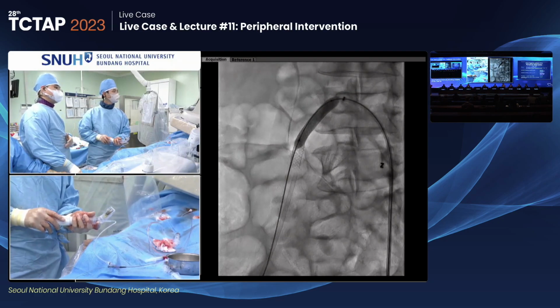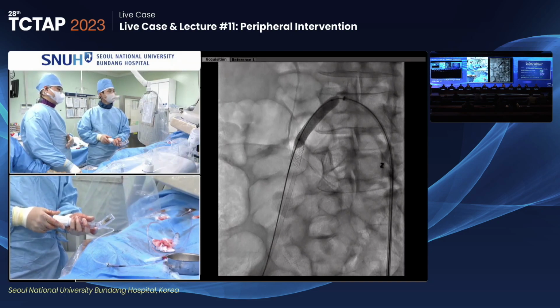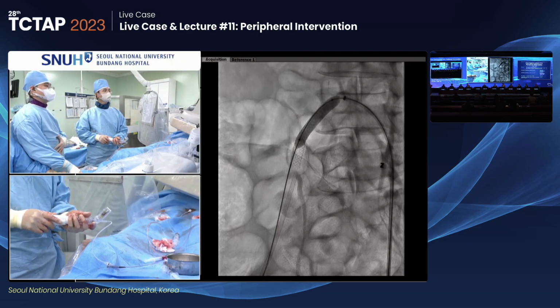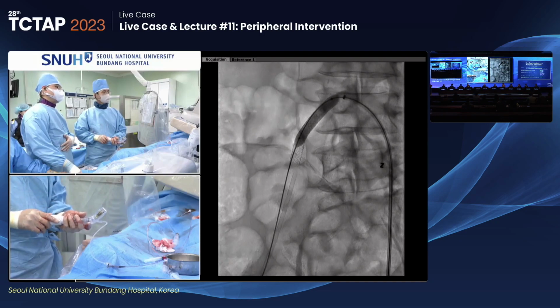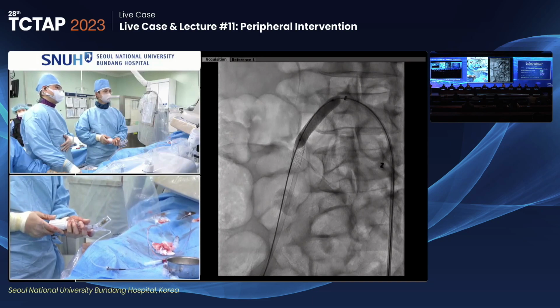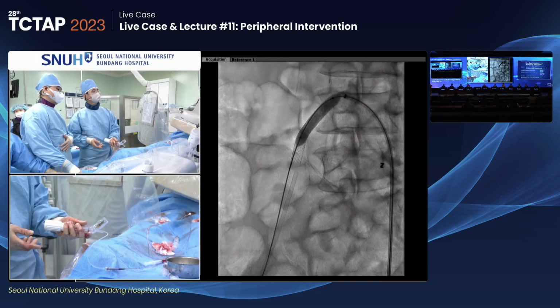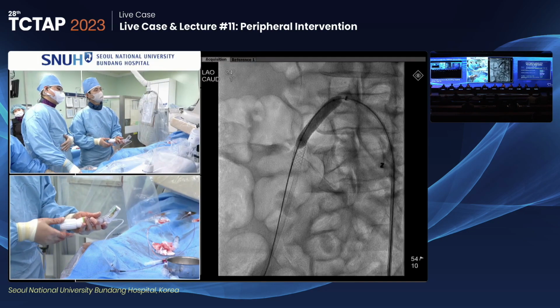Yes? It's tolerable. 4 ATM. Nominal? 6 ATM is nominal pressure of 8mm balloon. So the vessel is over 10mm, so I don't think the vessel ruptured using this 8mm balloon. So I touch the nominal pressure here. Safe. And well dilated.